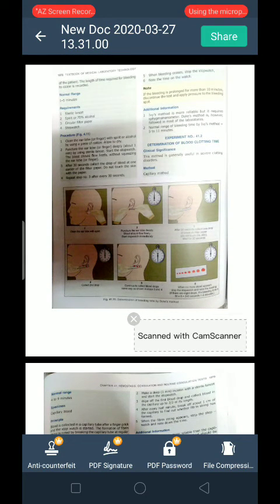Good morning, students. Today in this lecture we learn the determination of blood clotting time. This test is used to check the qualitative measurement of clotting factors which are used in the intrinsic pathway.